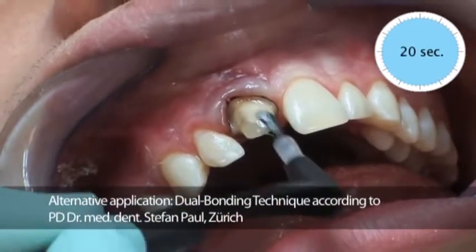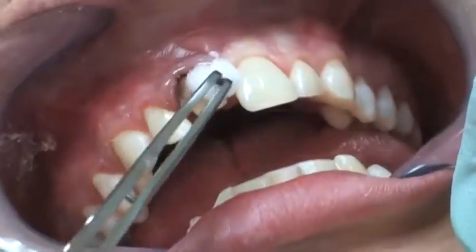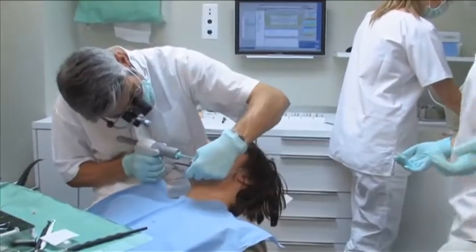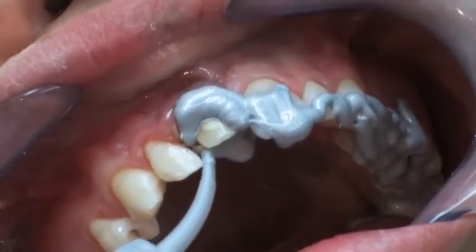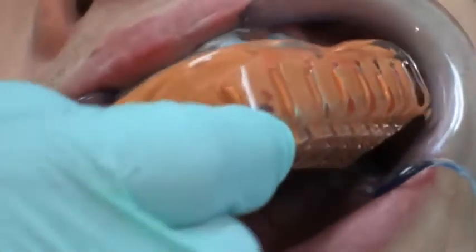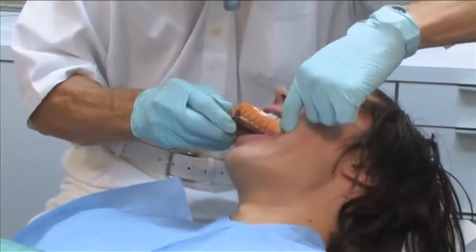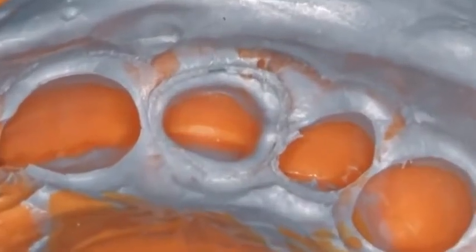Dr. Paul describes this as the dual bonding technique. The oxygen inhibition layer must be removed afterwards leaving no residue. Using the convenient micro system dispenser, the wash material is easily applied directly into the mouth. Filling of the tray and syringing the wash material should be completed simultaneously. The one-step putty wash impression is performed using a Finnis heavy body and a Finnis precious light body, a precision impression material that distinguishes itself by its easy readability of detail thanks to its silver pigmentation.